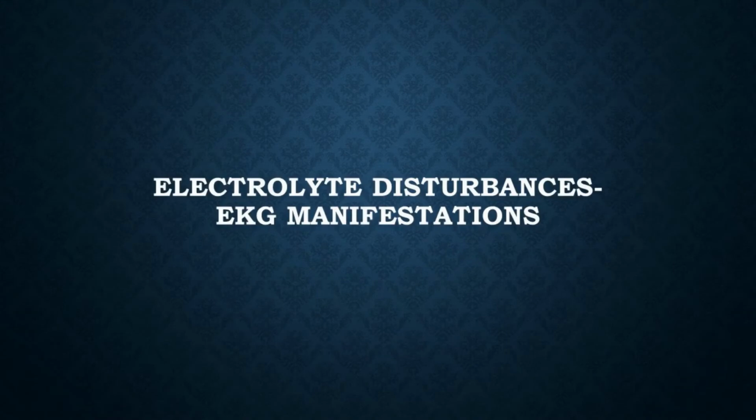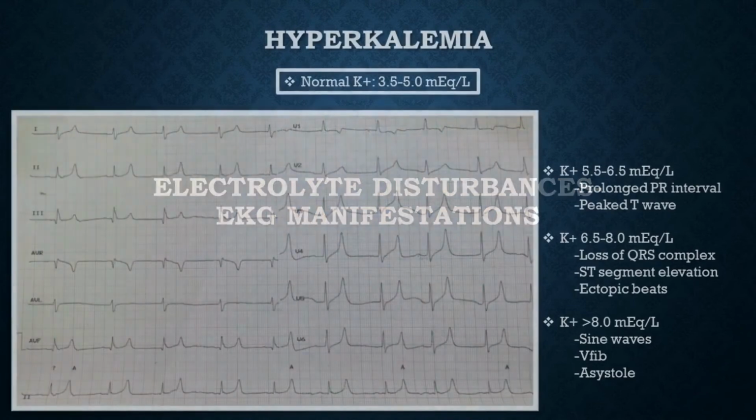You also need to know what changes to expect on EKG with different electrolyte disturbances. We'll discuss 4 of them. More details will be provided in the nephrology videos, but here is a quick recap.